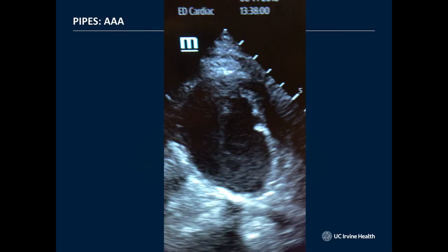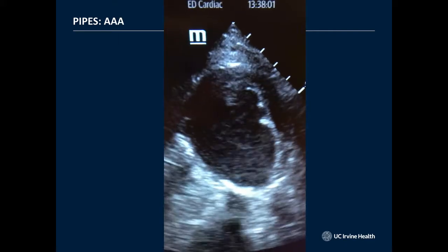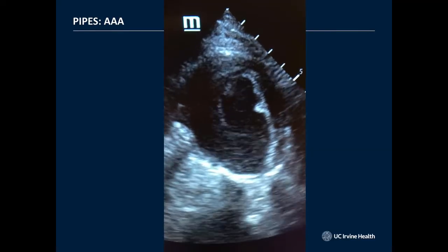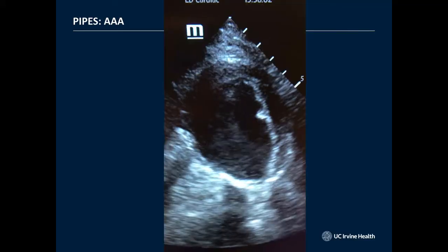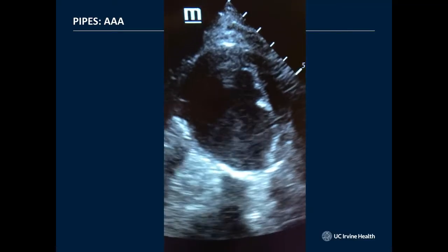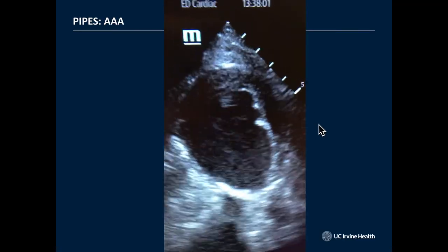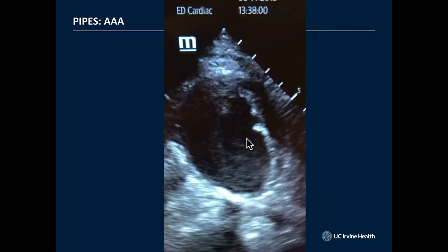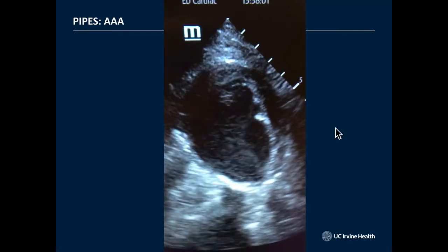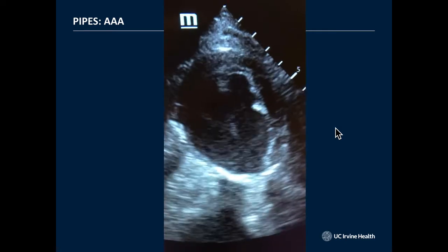Okay? Moving along here, this was an interesting case. This was Dr. Megan Osborne, who saved the day on Catalina. She had a patient who came in there, and she took this video using her cell phone. I happened to be in Ireland, and she sent me the video and said, check out this AAA I found here. And so here you can see the hash marks, the centimeter hash marks coming down the side here. I mean, this is a good, probably, 7 or 8 centimeters here. You see blood kind of swirling around in there. And indeed, she got that patient off that island and into an operating room on the mainland side where the patient had a really good outcome.